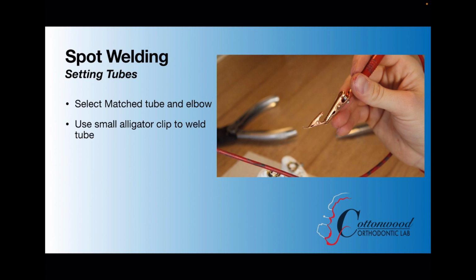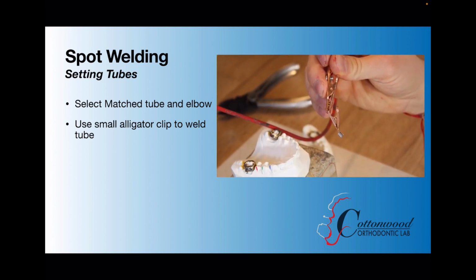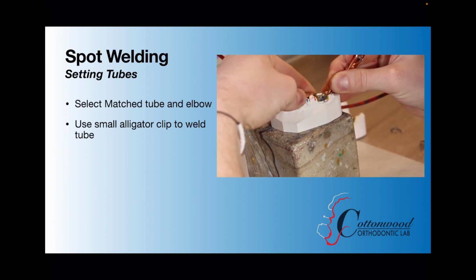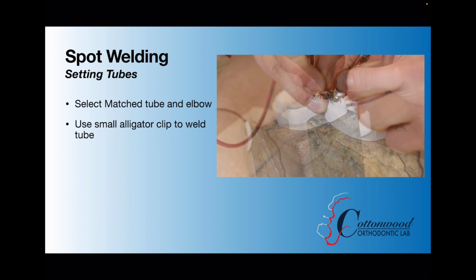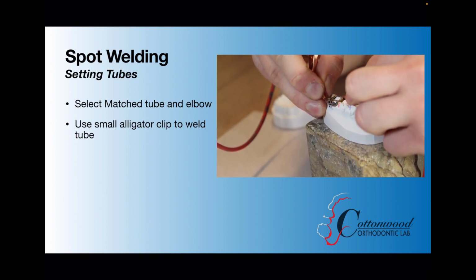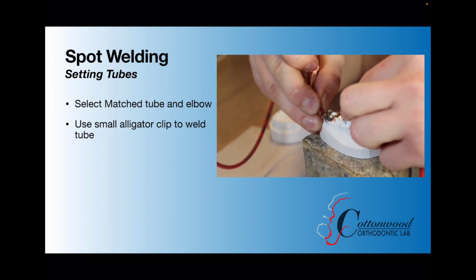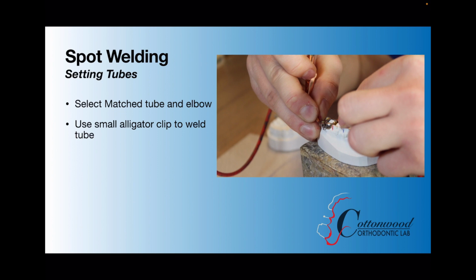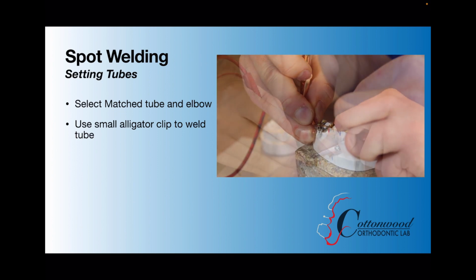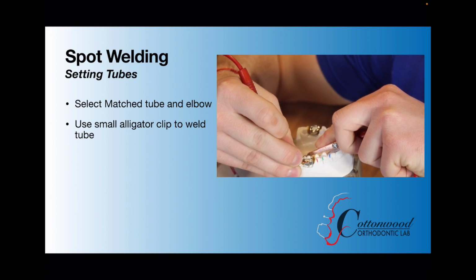Yep. So you can see there, we use that alligator clip to slip into that tube, and we're going to put it on that archwire tube. And we like to generally set it about 1 millimeter away from the band. And then once again, you're going to draw that posterior line of that arch like you saw on the upper, and you're going to make that parallel to that. And make sure that you get a good placement of that tube for starters. You might have to rotate that tube around in order to make sure, but you just get it set in there.